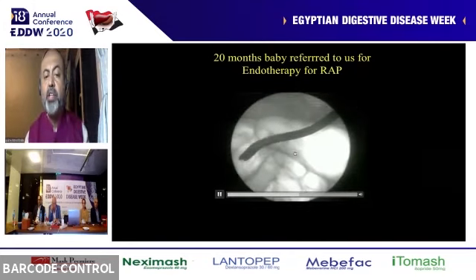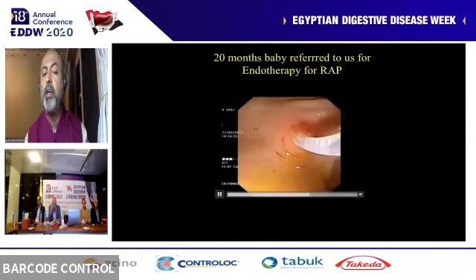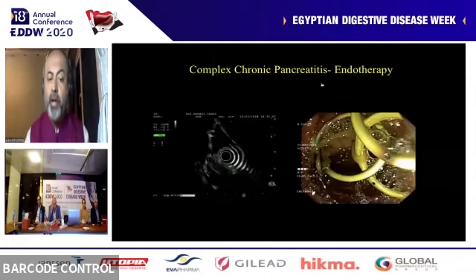You can see the wire here. And when I inject contrast very gently, just to demonstrate that this was a fluid collection which was impinging on the duct, the child was not thriving. So EUS pancreatic endotherapy interface is a brilliant way to handle this.